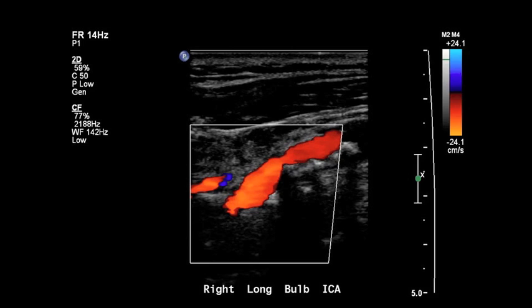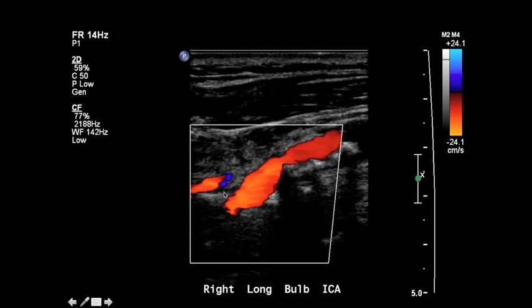This is a color Doppler image. What color Doppler does is it assigns a particular color value to things that are moving away from the transducer and another color value to things that are moving towards the transducer.